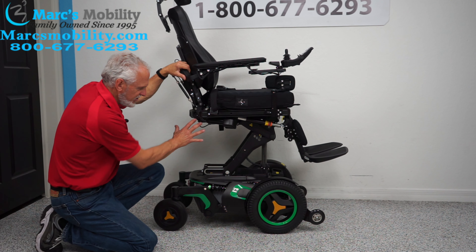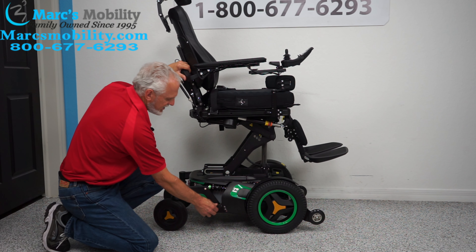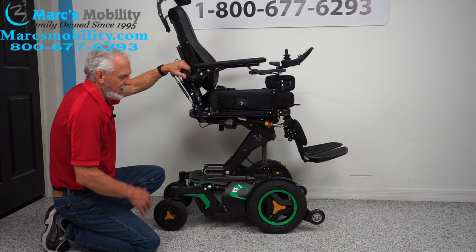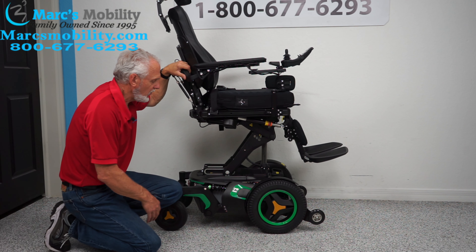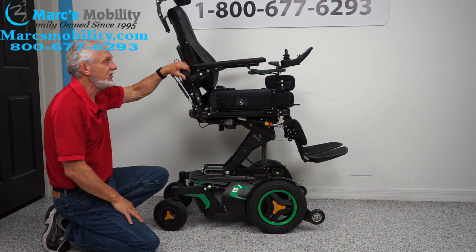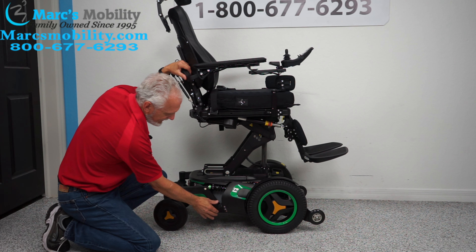There's a motor for each wheel on each side. You can't see the motor because it's behind here and goes directly to the hub, but you can see the lever right here. If you want to push this chair — let's say you forgot to charge it or have an issue — make sure the power is off first. You want no resistance in the motors. When the power is off, push this lever down.